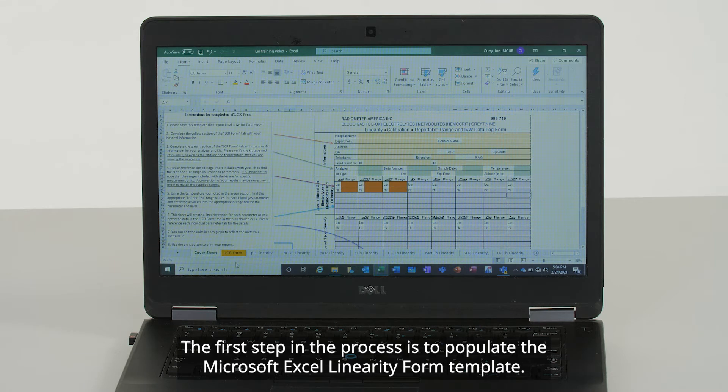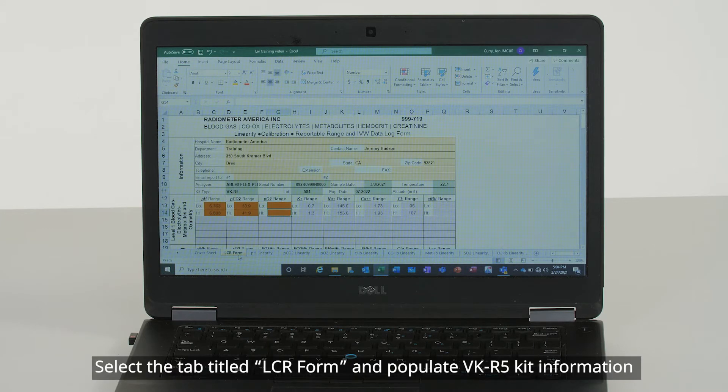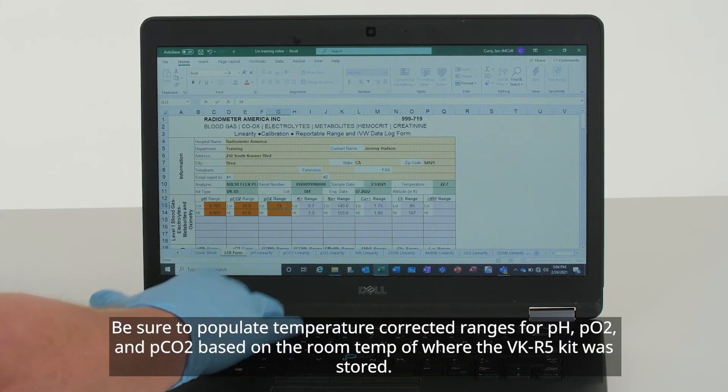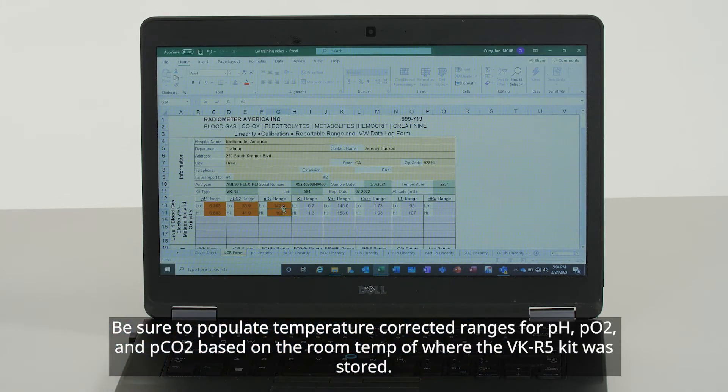The first step in the process is to populate the Microsoft Excel linearity form template. Select the tab titled LCR Form and populate VK-R5 kit information: lot number, sample date, parameter ranges, etc. Be sure to populate temperature-corrected ranges for pH, pO2, and pCO2 based on the room temperature of where the VK-R5 kit was stored.